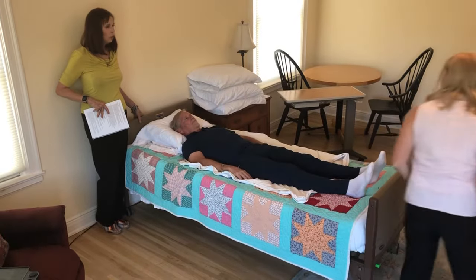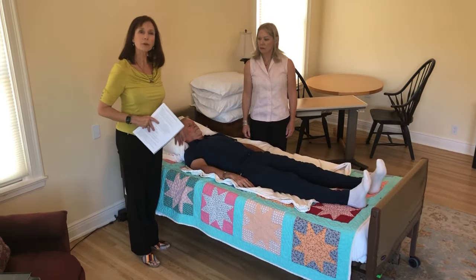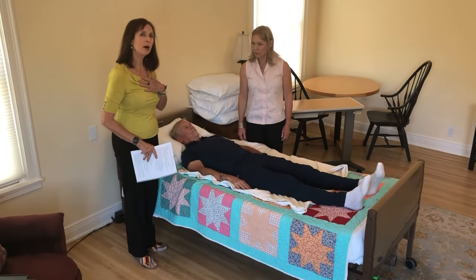Okay, we now have a sheet under our patient, Dan, and now we can use that sheet to put him into a comfortable position without yanking on him. We'll be using the sheet to move him, and it's going to be a lot easier for our own bodies.